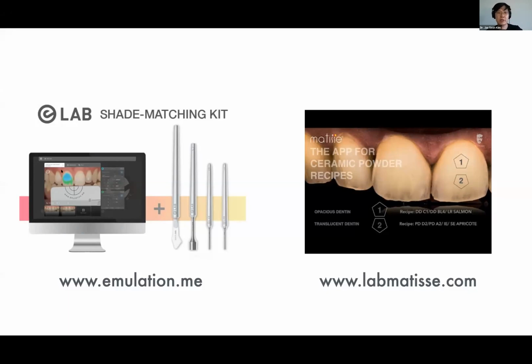And if you layer it as the software tells you, they're claiming that it can come to a pretty close match. And this is a similar system, the Matisse. You take cross-polarization photos, and you put them in their software, and they give you basically these recipes that you can follow.